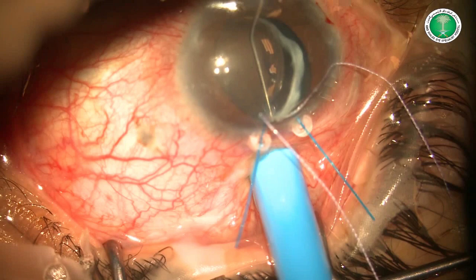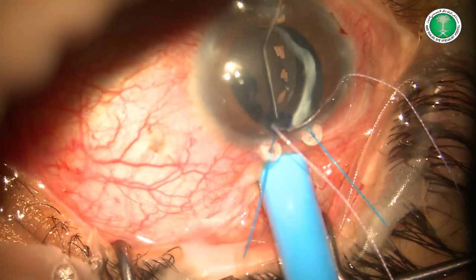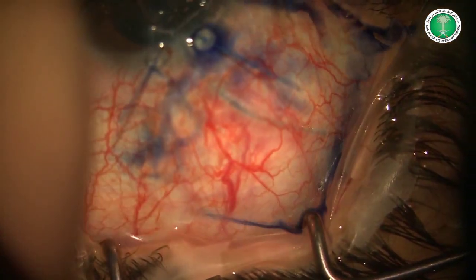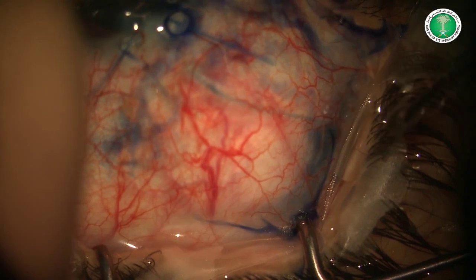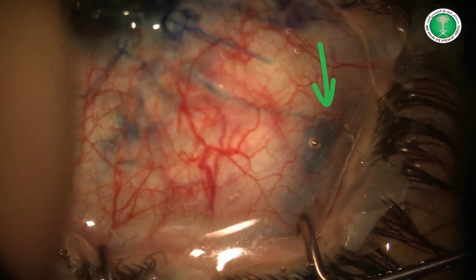In order to further confirm outflow patency through the drainage device, TriPan Blue is used to flush the tube. Here we can see the stain nicely flowing through the tube up to the plate, with a nice bleb forming in the conjunctival space surrounding the plate.